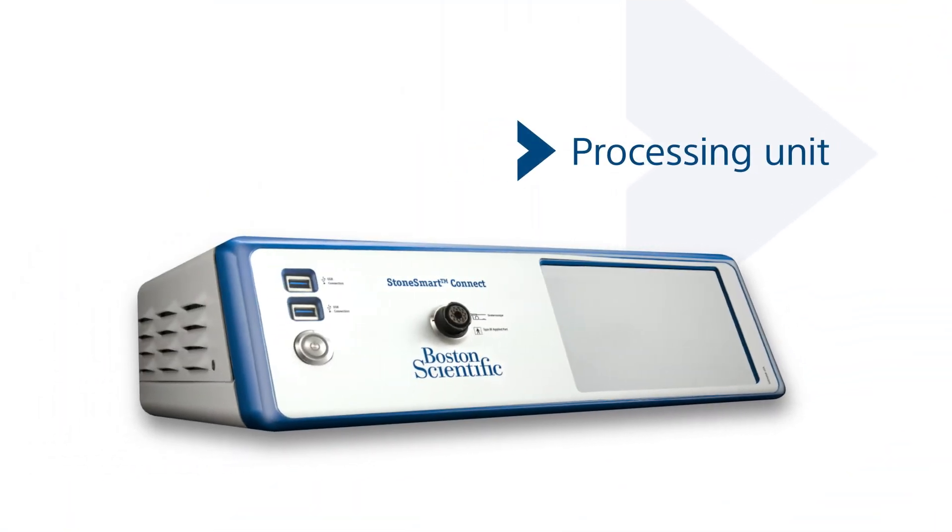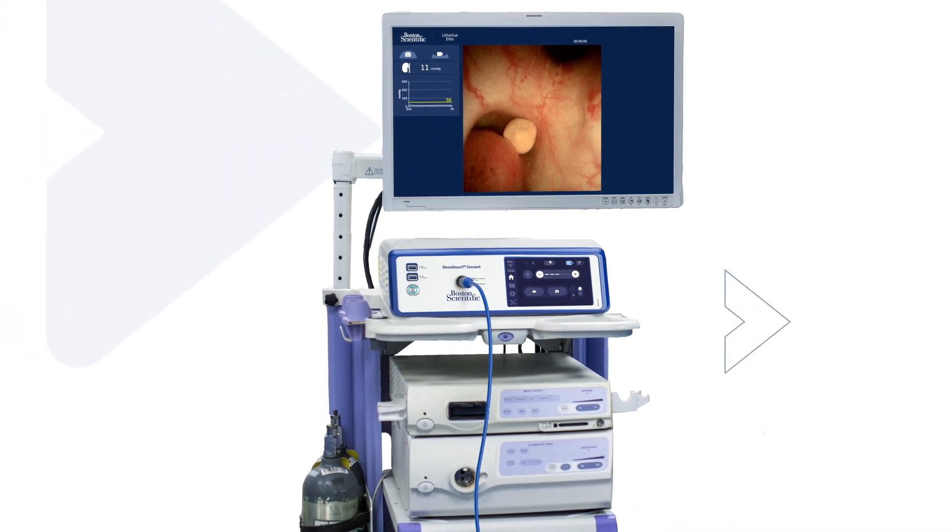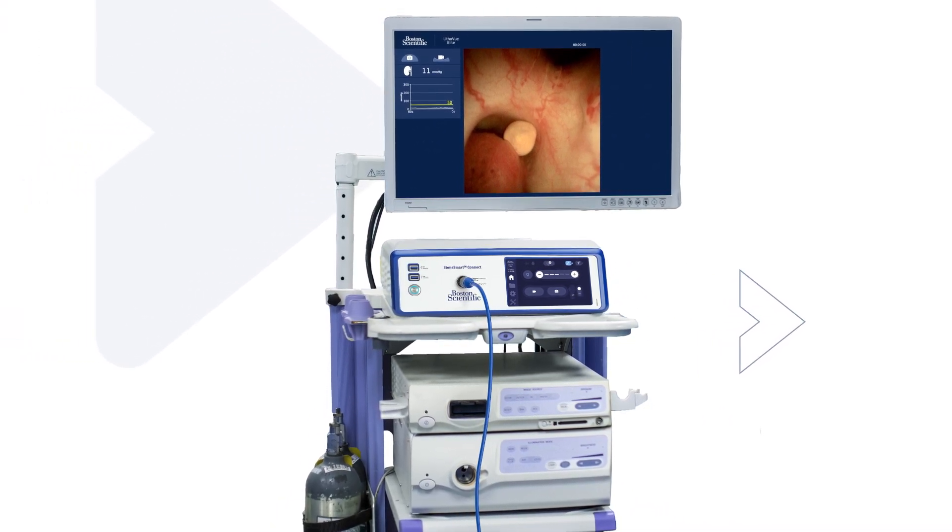Its processing unit streamlines your operating room's logistics by integrating into your OR or existing mobile visualization tower, creating less clutter and minimizing capital footprint.